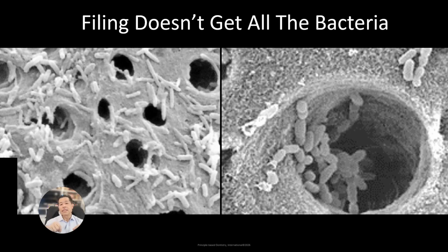And then we're going to use our EDTA to remove the smear layer. It's a chelator, so it's going to open up all these tubules. Then we're going to go back in with our sodium hypochlorite, and we're going to use our activation to force our sodium hypochlorite into all these small spaces. And then we're going to be able to really, truly disinfect that tooth.